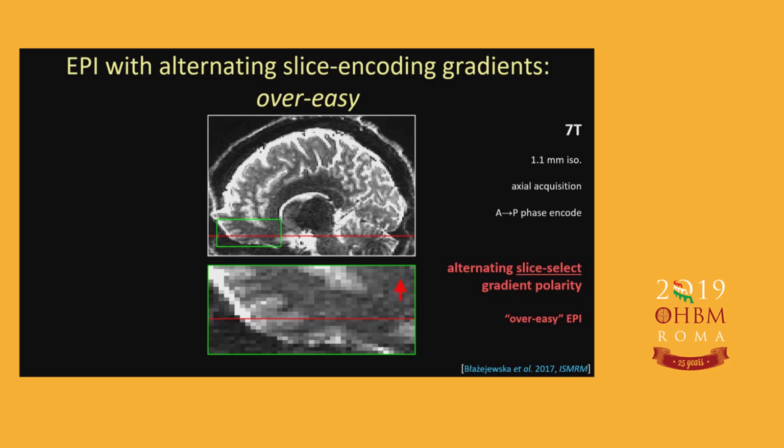So what this means is that there is appreciable distortion in this direction. If you do try to estimate a B0 map to correct for the distortions in the EPI data, it's important to take these distortions into account, as well as the distortions along the phase encoding direction. But again, if we acquire anatomical reference data that's exactly distortion matched to the fMRI, these distortions are not something that we need to be concerned with.